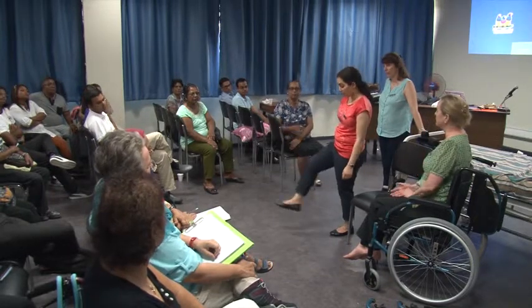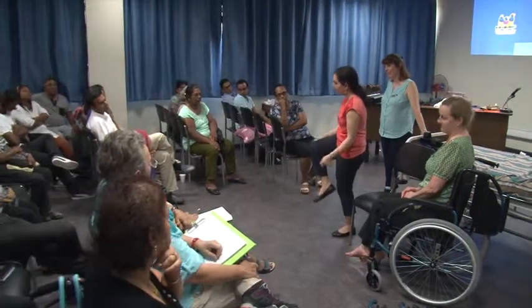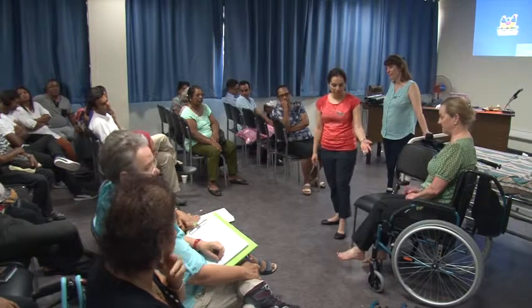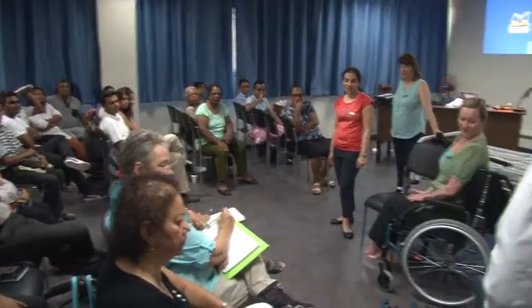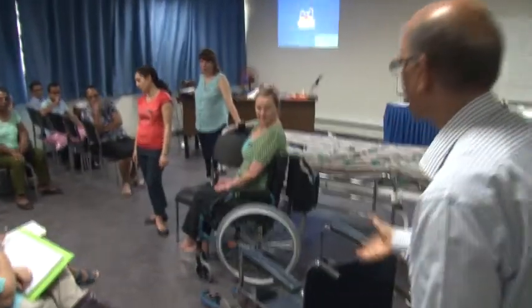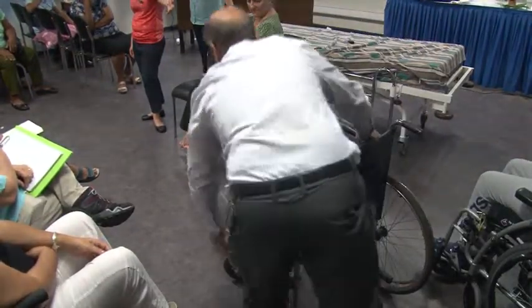If the feet are not touching the foot plate, it's too low. And if the knees are up like this, the foot plate is too high, so you have to adjust. And if there is no adjustability, the chair is not right for the person. This is the kind of wheelchair they provide with the Ministry of Social Security. They are fixed, which is not appropriate. So please, when anybody is given this chair, please make a noise, shout that this is not appropriate.